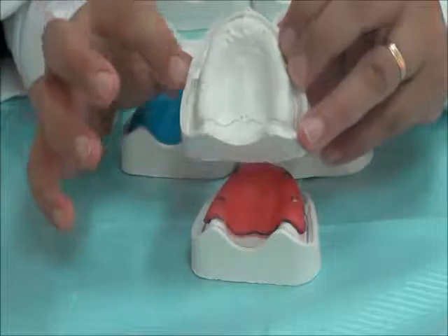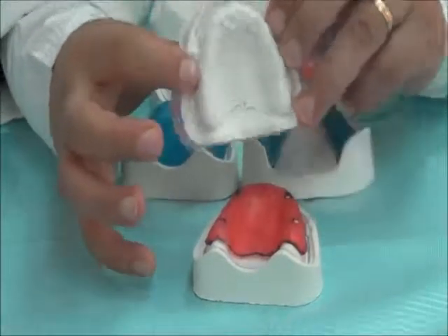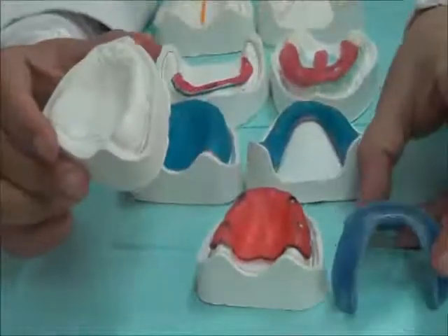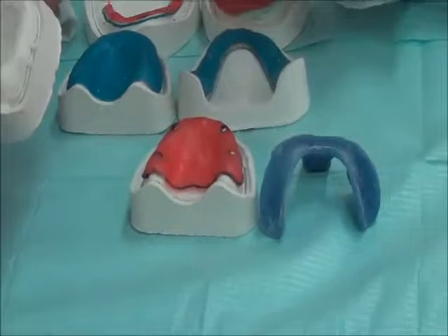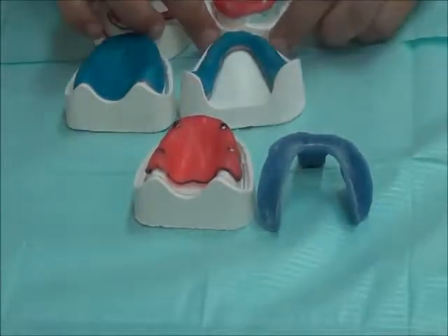So also the denture could go through the sulci and cause trauma to the patient later on. So taking a case where no relief is present or full relief is present are both hazardous to the patient in the long term and might cause harm. So for our purpose we choose to do partial relief.